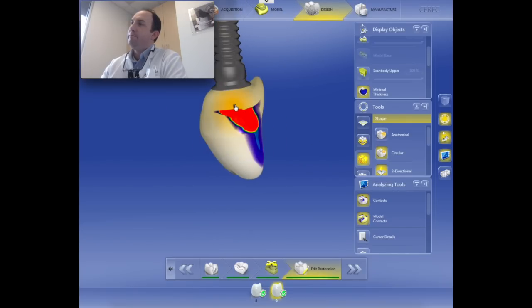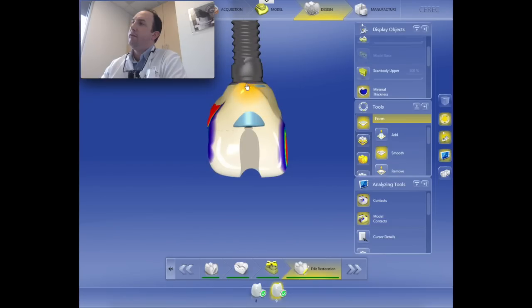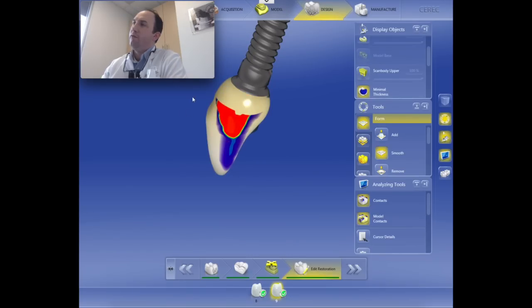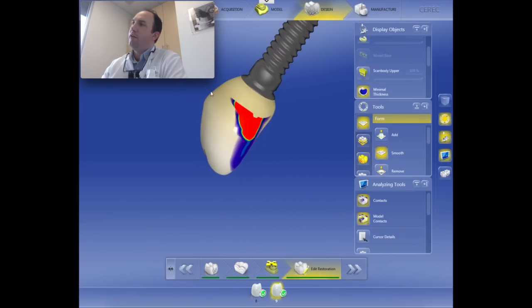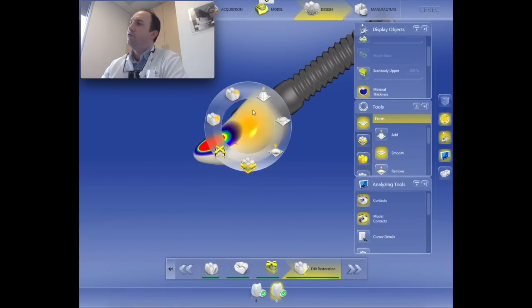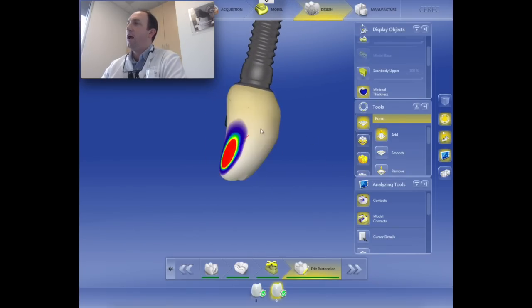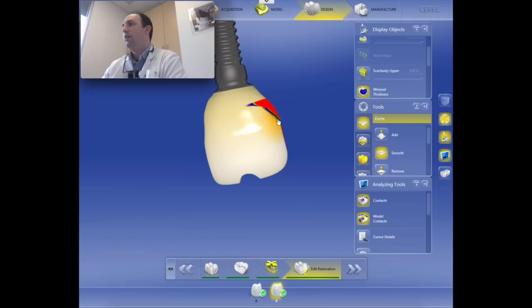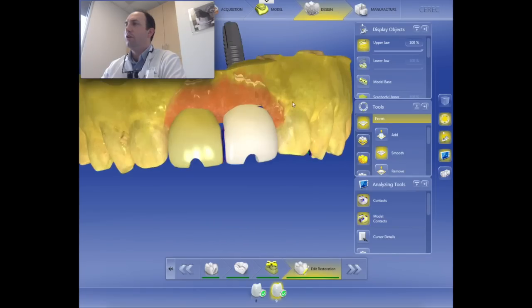So we want the gingiva to be shaped by the crown, not the other way around. I don't want the crown to accommodate the gums. I want the gums to be trained by the crown. Now, we can certainly do that any number of ways. I could put in a temporary, a PMMA or a Telio block or something acrylic that would train the gums, and then come back in, take an impression and design based on the gum profile after the training. Or I can design the crowns to train the gums now, realizing I may need to contour just a little bit afterwards. Okay, so we're getting a little bit more normal looking.